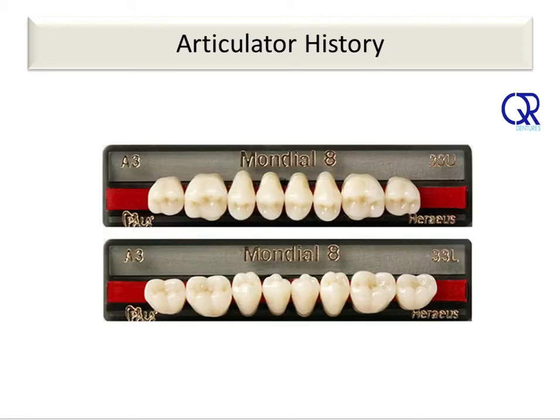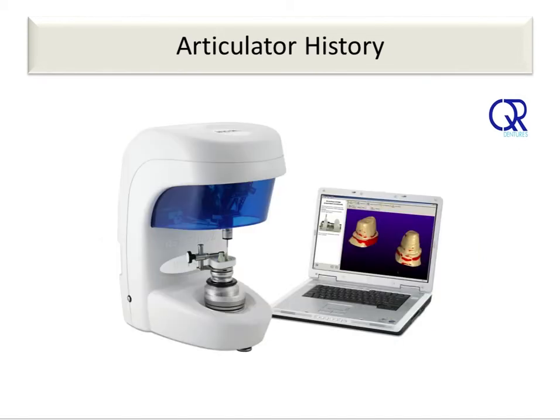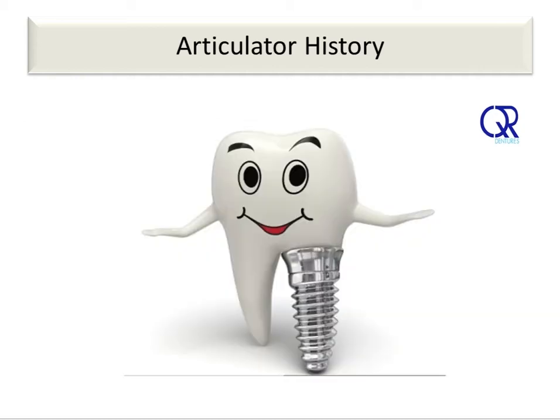And it is not only the articulating systems that we use that have these inbuilt inaccuracies, but also the denture teeth we use. They too are designed to be symmetrical on both sides to match the curves of Spee and Monson, and to match the linear movements of the articulators. Take it one step further and you will find our CAD/CAM systems also construct their frameworks to these curves. This could be one of the causes for a number of framework failures in the implant and crown side of our industry. Also why an implant retained lower denture produces an unstable upper denture.